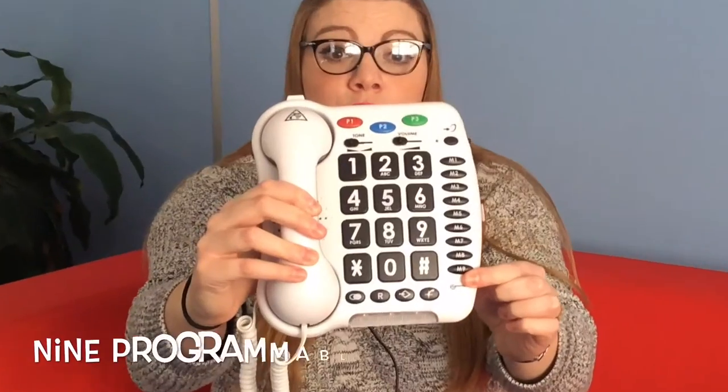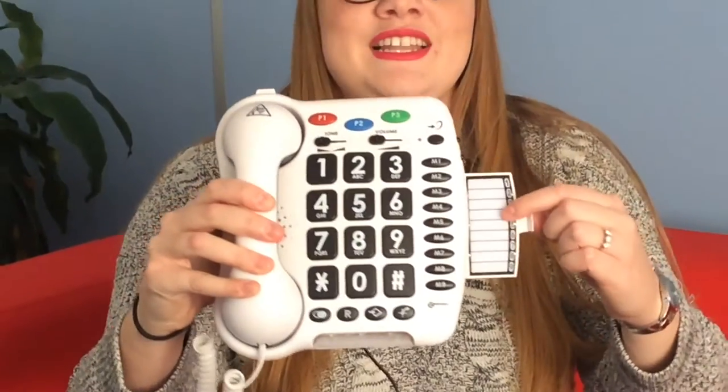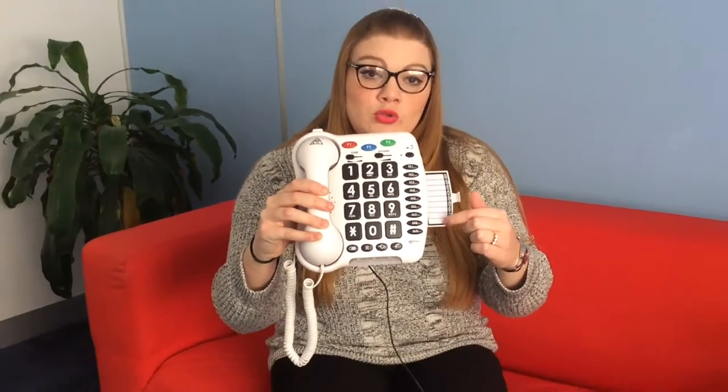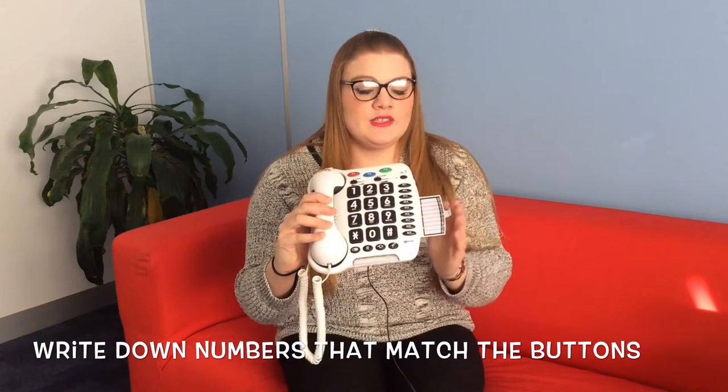Down the side there are nine other programmable buttons for your friends, family, and relatives' telephone numbers. You can pull out this handy little card and write down all the numbers that correspond to each button on the side, so you don't accidentally call someone by mistake.